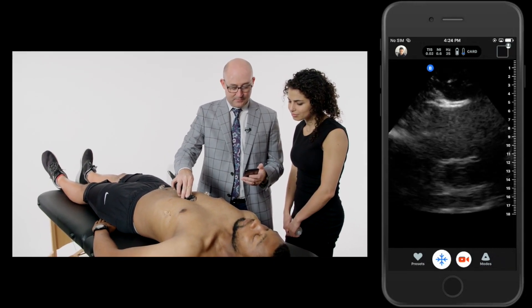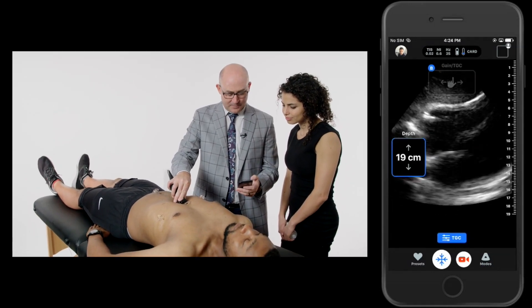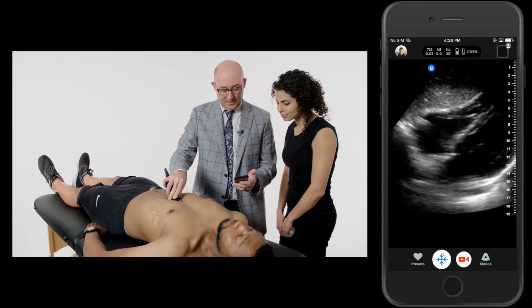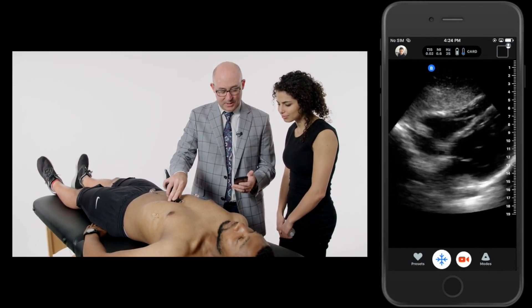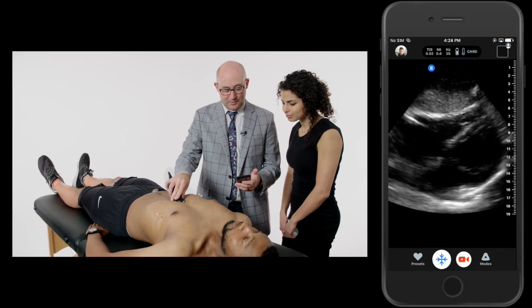Go ahead and take a deep breath. There we go. Maybe a little bit more depth. It takes a little tweaking of the probe and I start to see the right atrium, right ventricle, left atrium, left ventricle. I see the valves there. I see the liver at the top of the screen. I'm very happy with that image. No pericardial effusion there. Looks great.